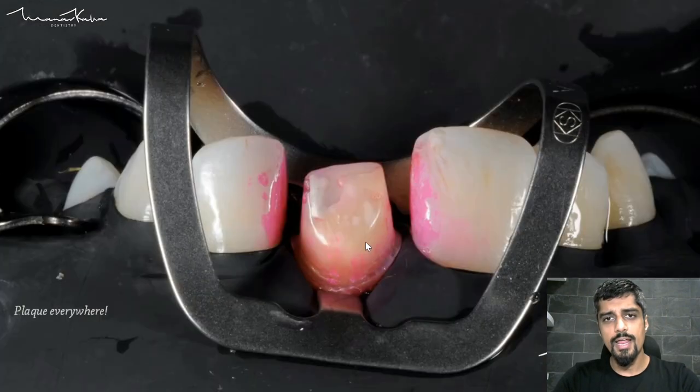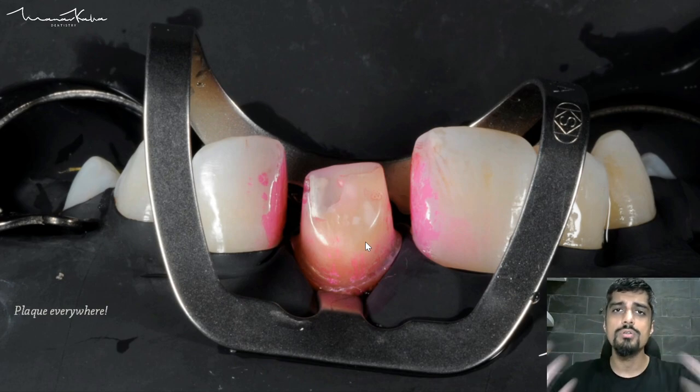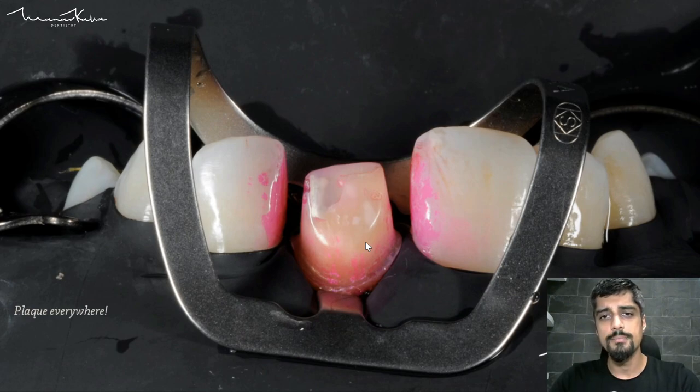This is the final trial, and now — this is important — before you bond, before you do any kind of cementation or use any kind of resin cements, it is very important to remove plaque. Please remember: self-adhesive resin cements or any kind of resin cements are not going to bond to the natural tooth structure in any way or form if there is plaque on the tooth.